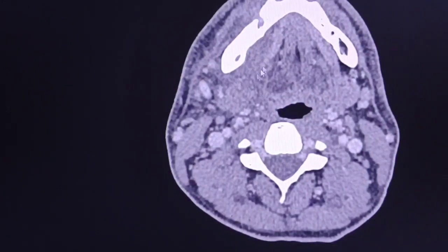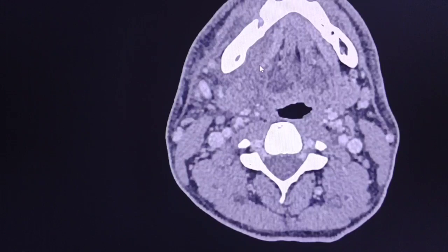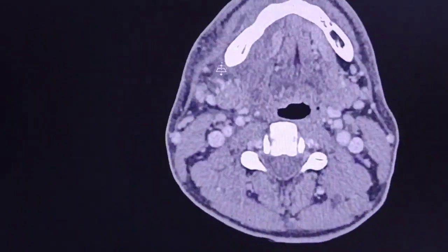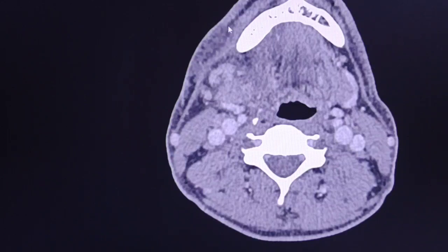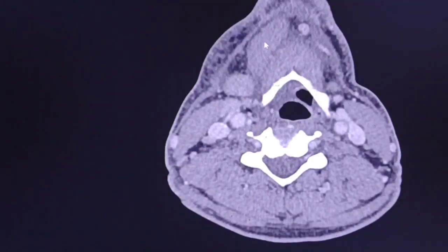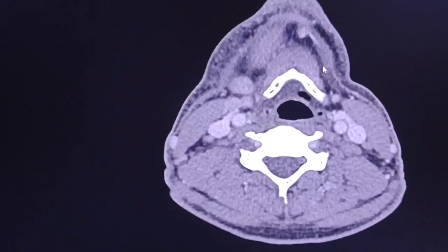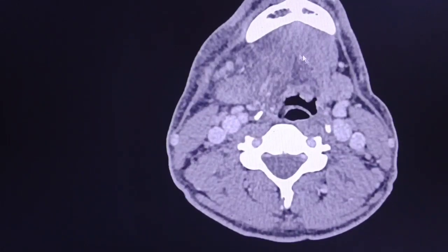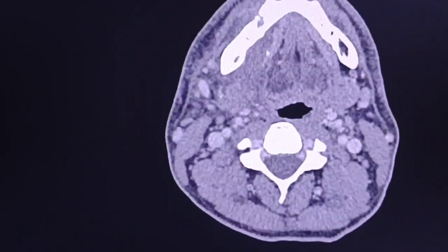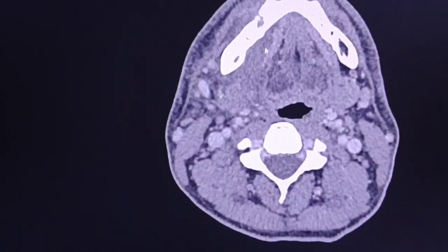So, the findings. As you can see, there is diffuse swelling and edema of the soft tissues on the right side of the body and part of the ramus of the mandible. There is swelling of the right platysma muscle and cellulitis in the subcutaneous fat. There is also swelling of the right mylohyoid muscle comparing to the left, and edema in the sublingual region. Given the appearances of low attenuation in this region, there is a suspicion of fluid collection.